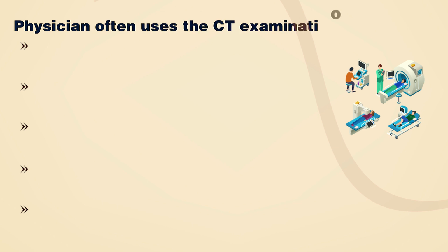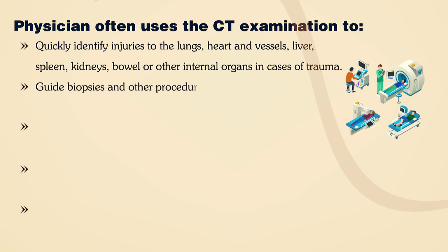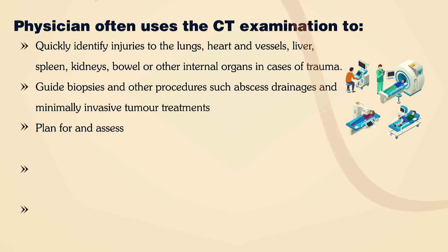Physicians often use the CT examination to quickly identify injuries to the lungs, heart and vessels, liver, spleen, kidneys, bowel or other internal organs in the case of trauma.